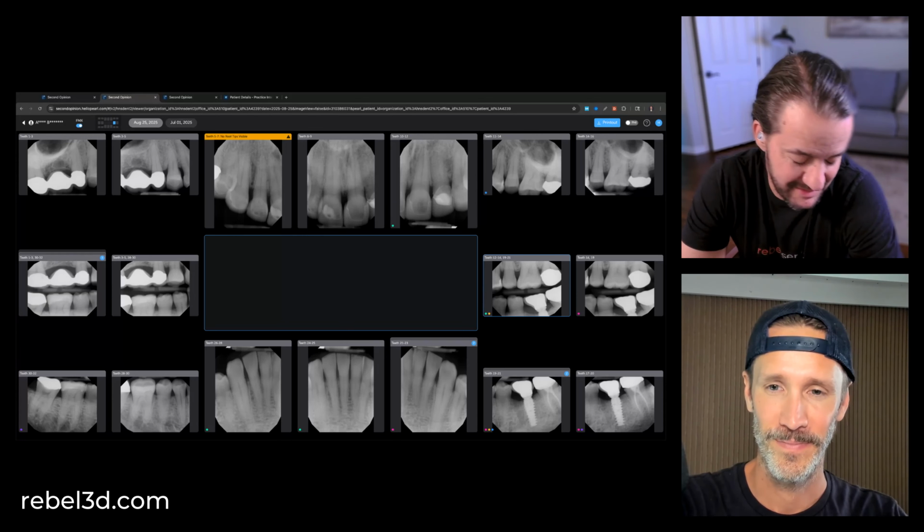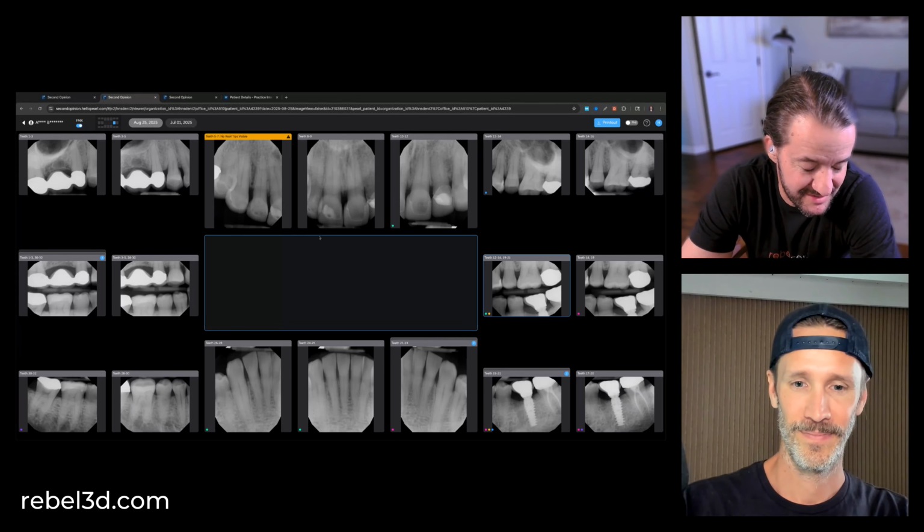That's amazing. I'm not surprised at that answer. I'm just assuming that your desire to reduce stress through this technology was probably long lived. Would it be a correct guess that as you're showing treatment through the lens of Pearl, your stress is reduced because you have this confidence that I'm not trying to sell, I'm just trying to explain what's going on?